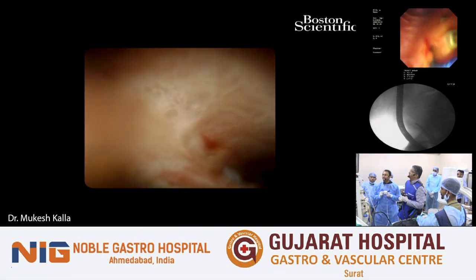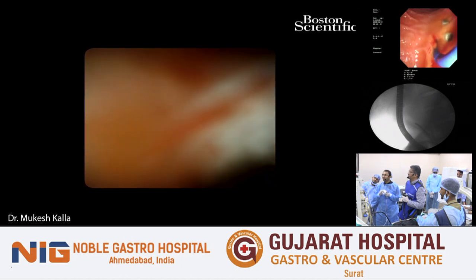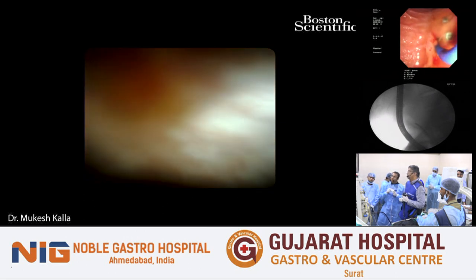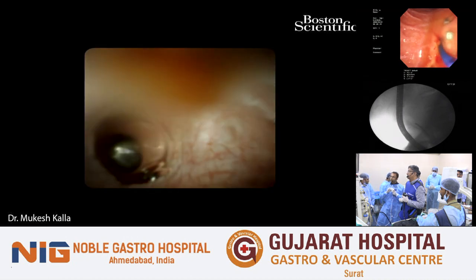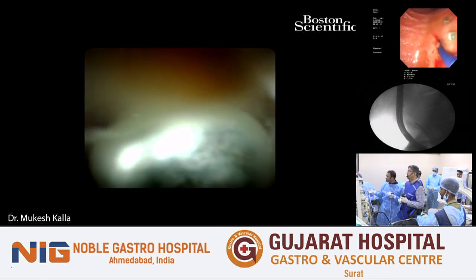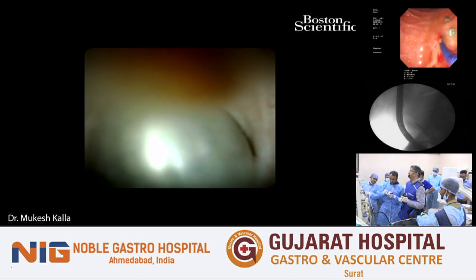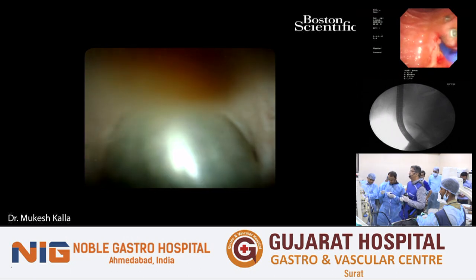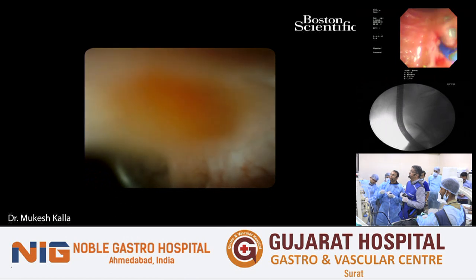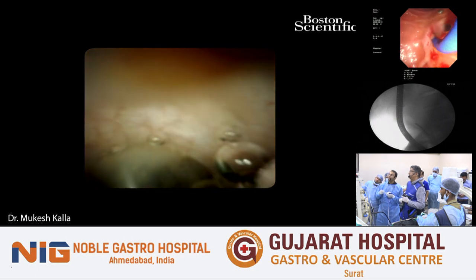Nilay and Saurabh, what's your experience with direct cholangioscopy? And do you have experience with the new Olympus catheter-based cholangioscope? Yes, Saurabh can answer. So I think direct cholangioscopy is, as you all are aware, fairly technically challenging, and pediatric endoscopes can be used, but it does require the bile duct to be dilated enough to accommodate the scope. I have personally used it in a couple of patients who had a fistula into the first part of the duodenum, where we used a pediatric scope for stent retrieval. But by and large, going through the ampulla and getting it up is a very daunting task with the currently available instruments.